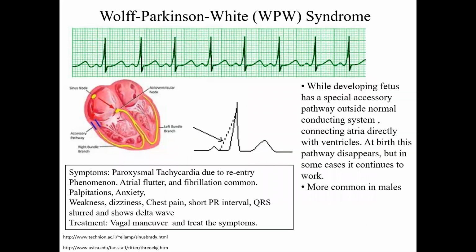This is called WPW. You may have heard of this in lecture. So this one's kind of subtle. You know, it has this early rise of the R wave, and that's called a delta wave. So it's really subtle.